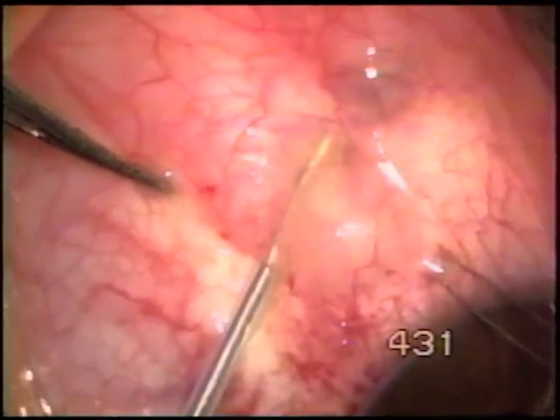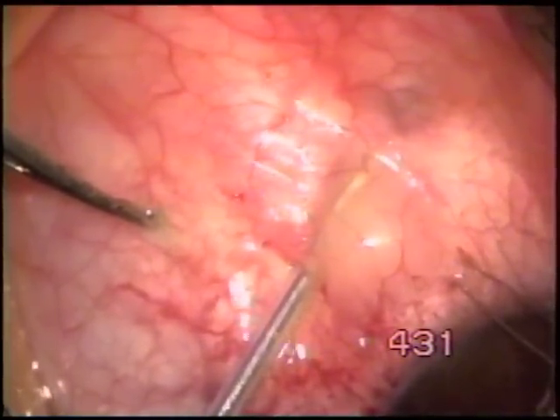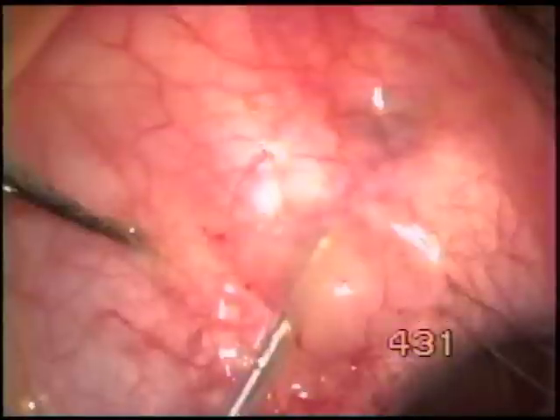I was expecting that there may be some bleeding from these relatively large vessels, but they are proving quite docile.